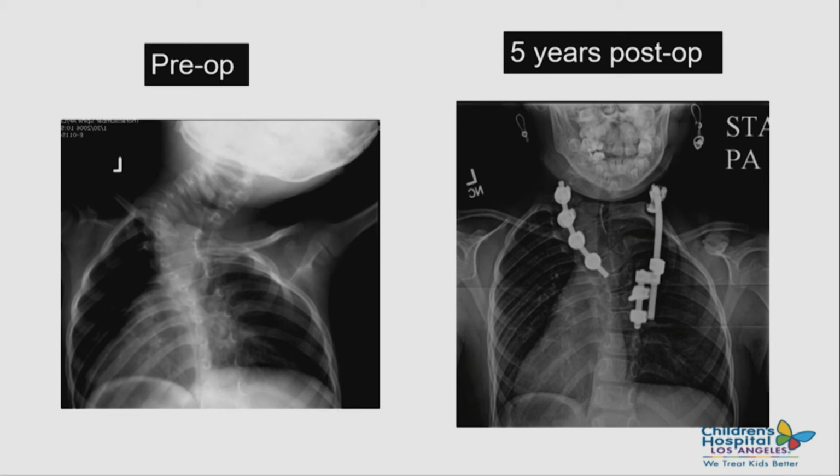I'm not sure what you're asking. Meaning, it looks like the Cobb goes up into the cervical spine, probably C5. Yeah, I think I went up to the highest hemivertebra. So whatever the highest hemivertebra was, I put in a screw there. Got it. And then you distracted off of the T1 rib. Yeah.